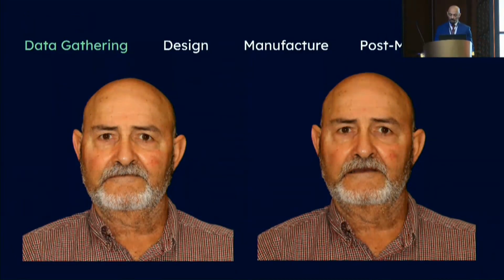Due to the time limit we are trying to stay within for today, I will only discuss significant findings and diagnoses related to the diagnostic phase. To start, the left-hand image shows the patient in a closed state, where you can start to see drooping corners of the mouth. The patient's teeth on this image are actually separated, and so biting down led to significant reduction in the lower third of the face compared to the middle.